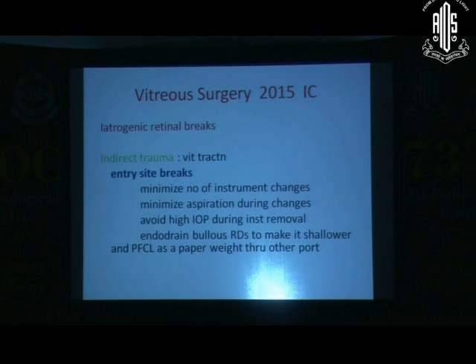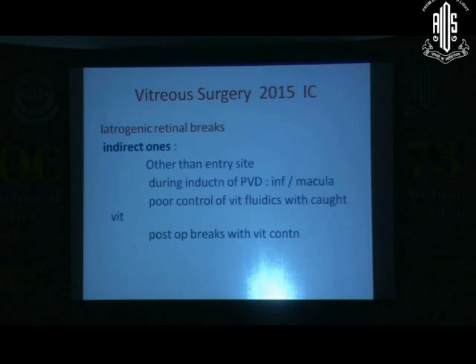Going on to the second topic of iatrogenic retinal breaks, we should see that we can induce these breaks by indirect trauma by pull on the vitreous. Here I would like to emphasize we should do a minimum number of instrument changes, minimize aspiration during removal of instruments, avoid a high intravitreal pressure when the instrument is removed, and endodrain bullous RDs to make them shallower or use PFCLs to avoid pulling the retina into the port.